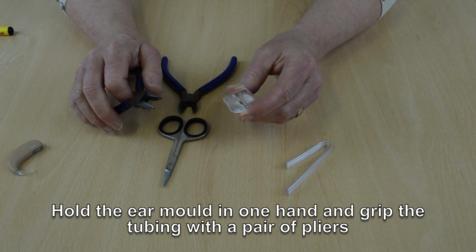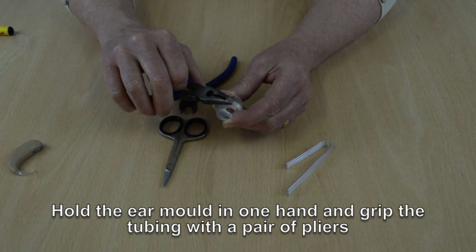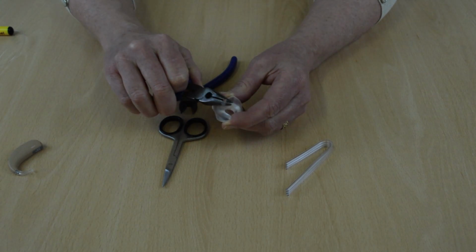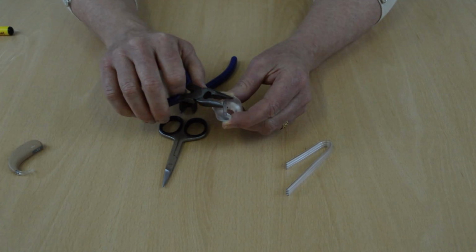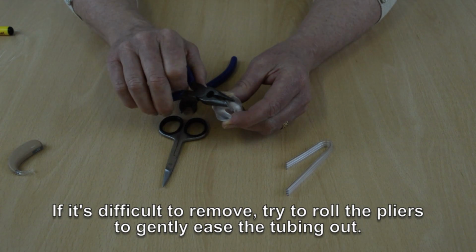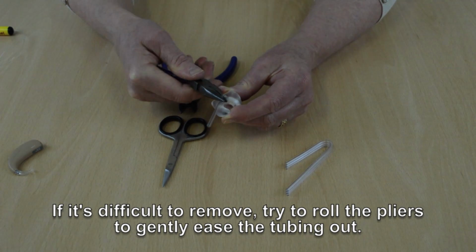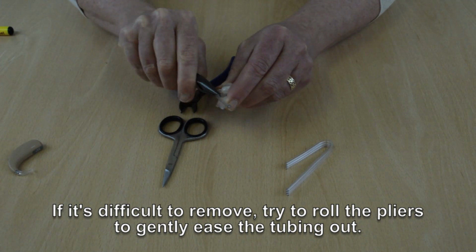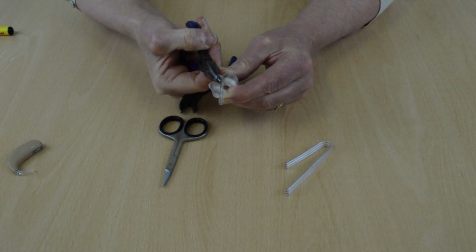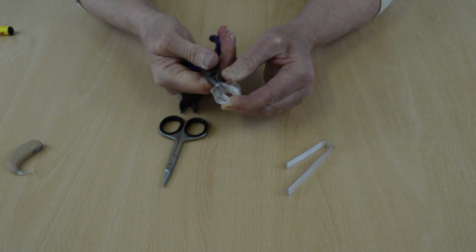Hold the ear mould in one hand and grip the tubing where it comes out of the ear mould on the outer side with a pair of pliers, and just gently pull with the pliers to remove the tubing. If it's difficult to get the tubing out, you can roll the pliers round and round to gently ease the tubing out of the mould rather than pulling very hard.